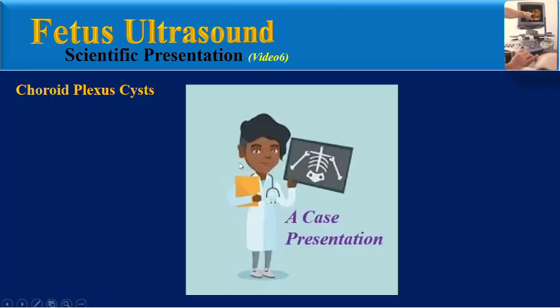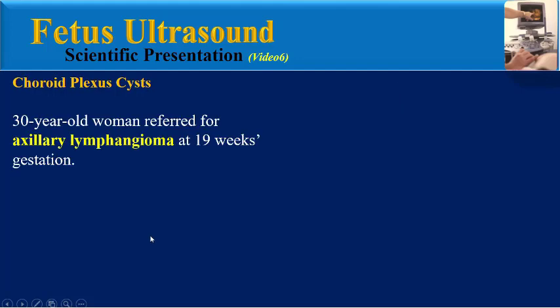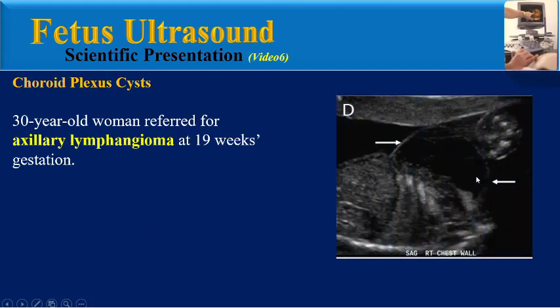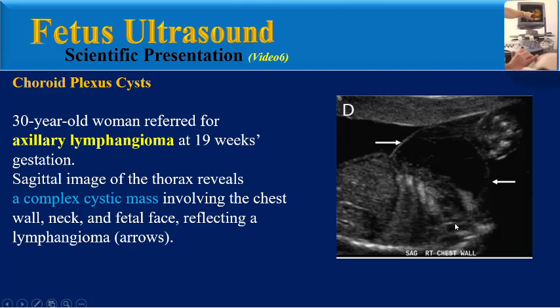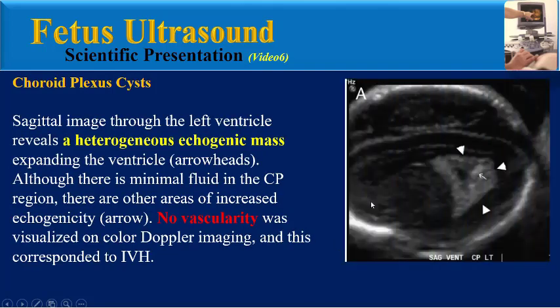Let me review a teaching case. A 30-year-old woman referred for fetal axillary lymphangioma at 19 weeks gestation. A sagittal image of the fetus reveals a complex cystic mass involving the chest wall, neck, and fetal face reflecting lymphangioma. Sagittal image through the left ventricle reveals a heterogeneous echogenic mass expanding the ventricle. Although there is minimal fluid in the choroid plexus regions, there are other areas of increased echogenicity. No vascularity was visualized on color Doppler imaging, corresponding to intraventricular hemorrhage.